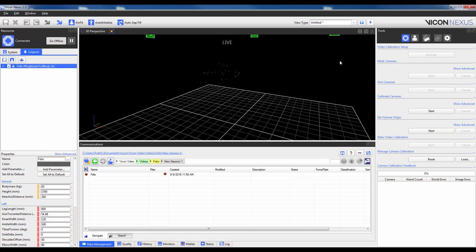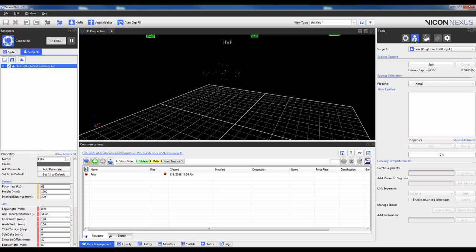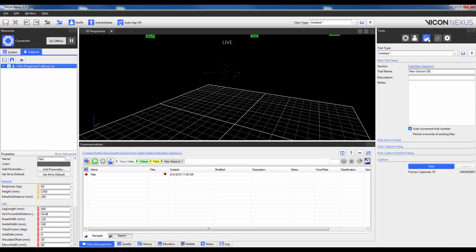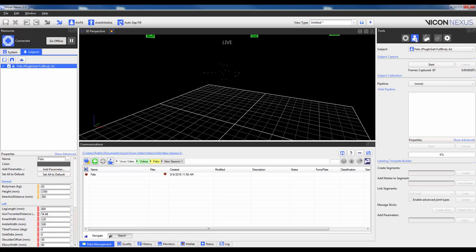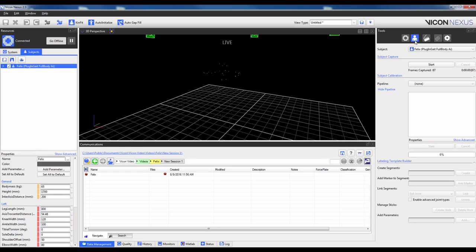In terms of recording the calibration trial, this can either be done from the Subject Preparation tab or from the Data Capture tab. The main differences of capturing within the Subject Preparation are that the trial name will be based off of the subject name with the suffix cal appended, and that analog and video data will never be captured. If you want either of these two options, you will have to capture from the Data Capture tab. In this example I will capture from the Subject Preparation tab and then show how this may be done later in the Data Capture tab.